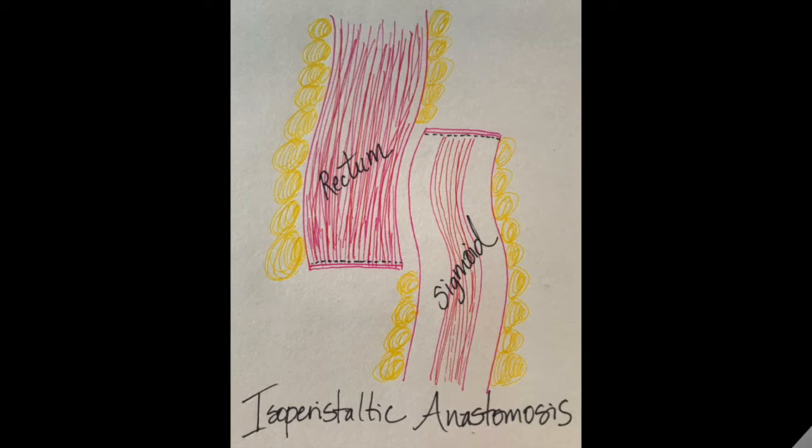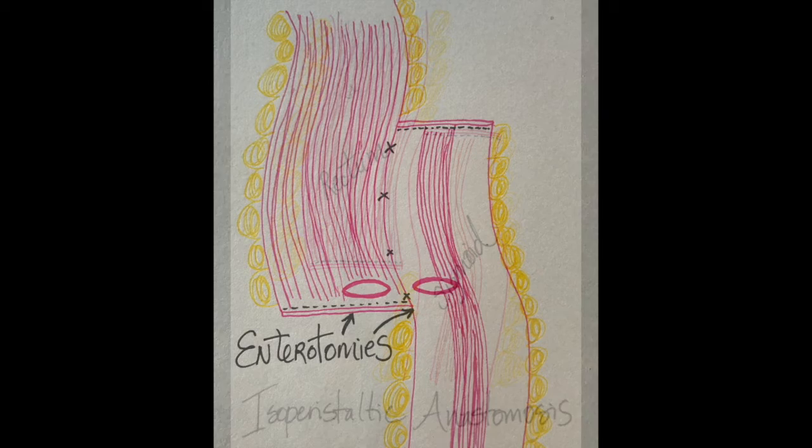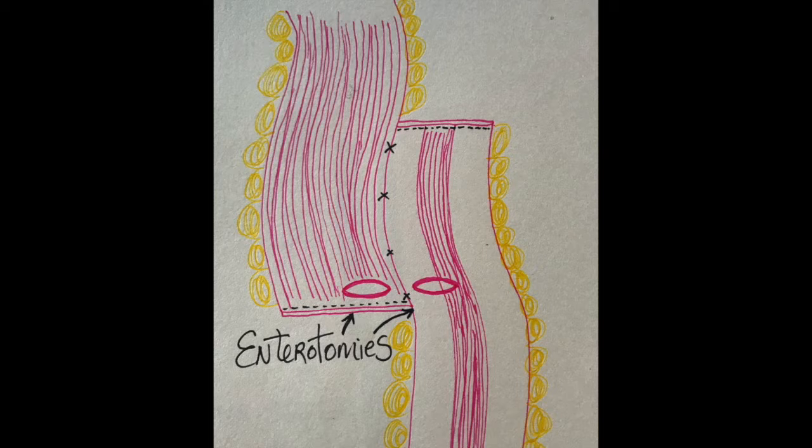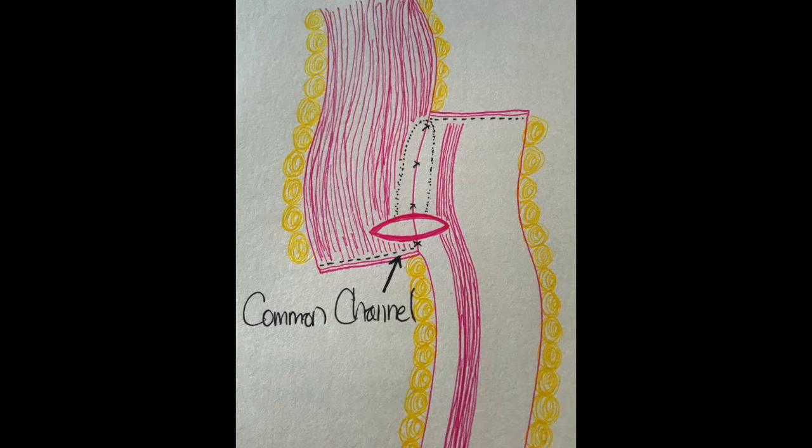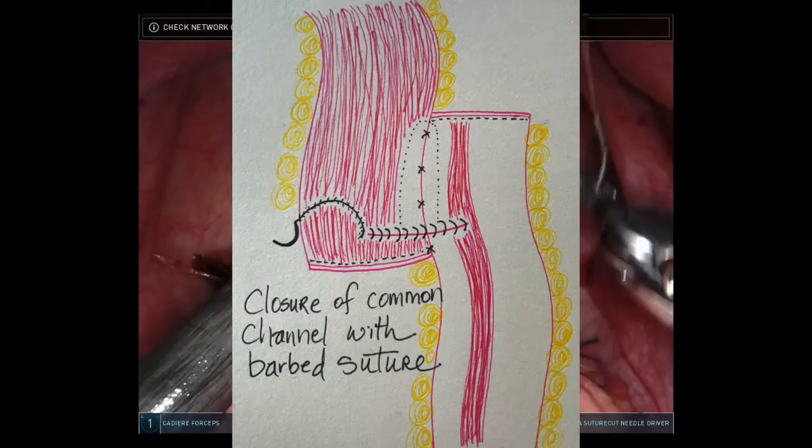We elected to perform an isoperistaltic anastomosis. Here is a primer on how this is created. We place the sigmoid and the rectum side by side and then, utilizing either vicryl or silk, we place several tacking sutures. Full thickness enterotomies are created using the hot shears as shown in the diagram above. A linear stapler, usually a green load, is then inserted through the enterotomies, closed and fired to create the common channel. Using a 2-0 monofilament barbed suture, we close the common channel in a running fashion.